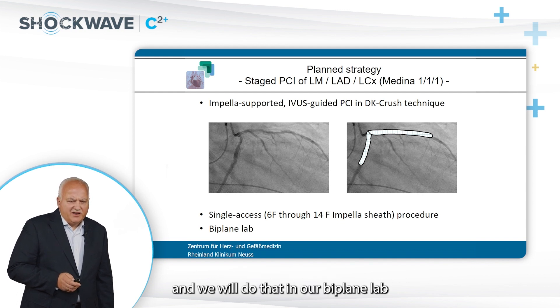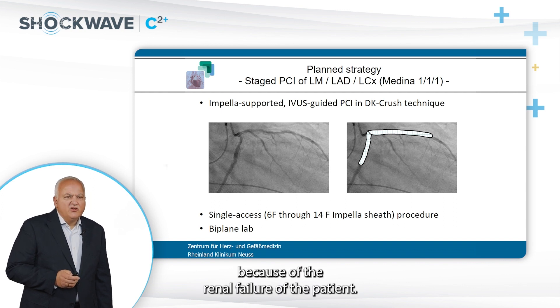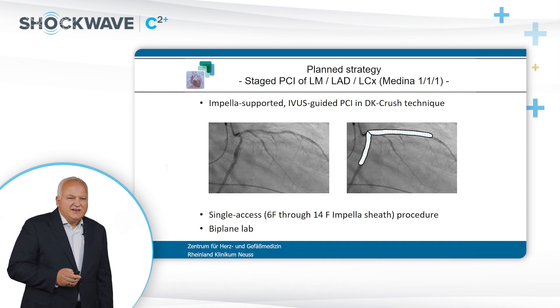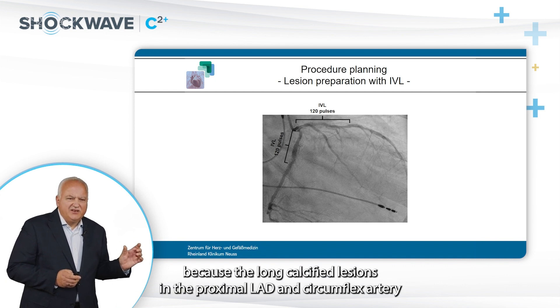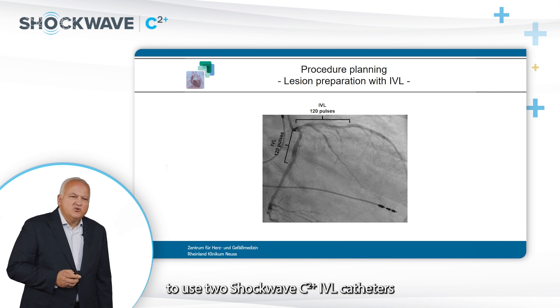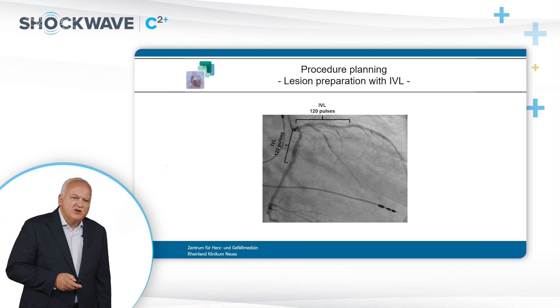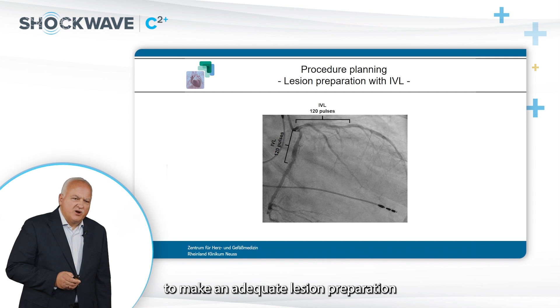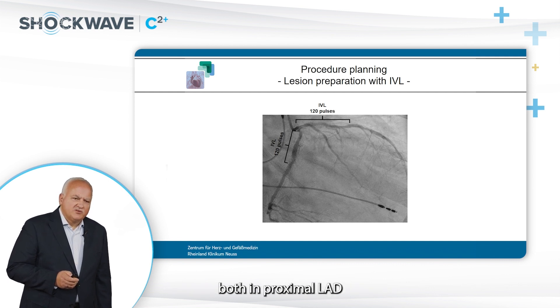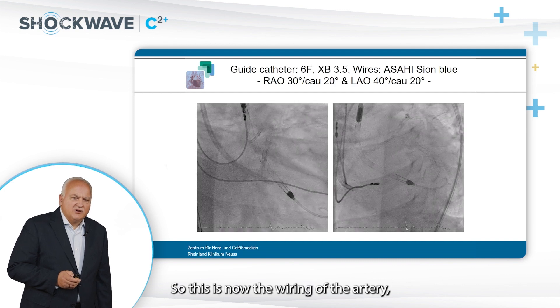We will perform the procedure in our biplane lab to save as much contrast as possible because of the patient's renal failure. Our goal is to use two C2-plus IVL catheters for both arteries — twice 120 pulses — to achieve adequate lesion preparation for the heavily calcified long lesions in both proximal LAD and proximal circumflex artery.